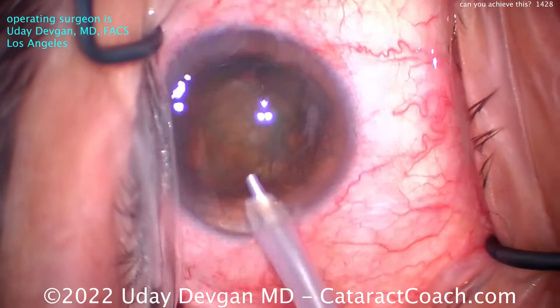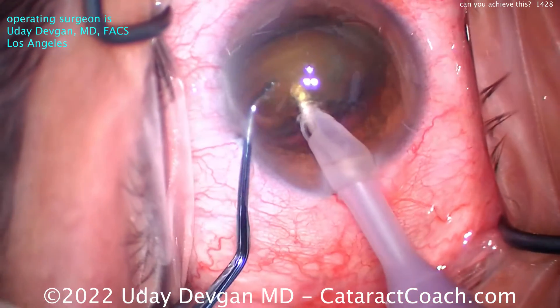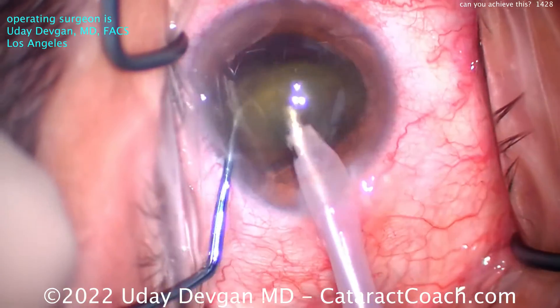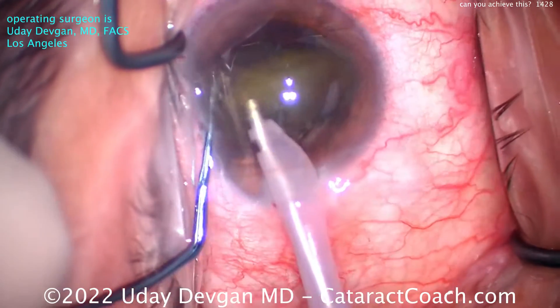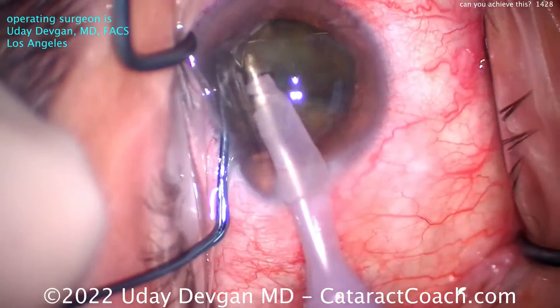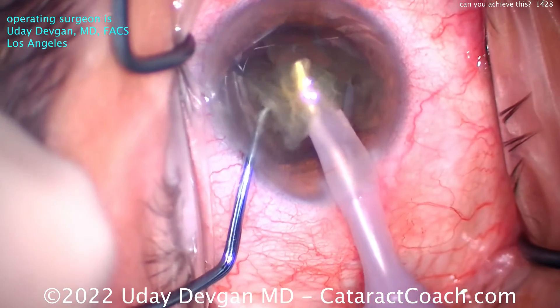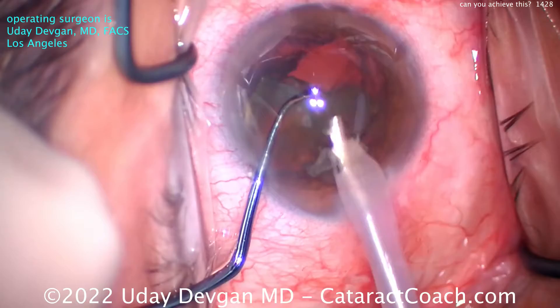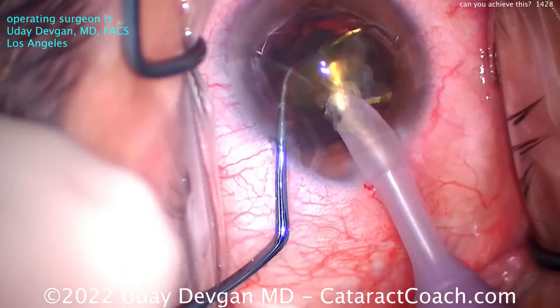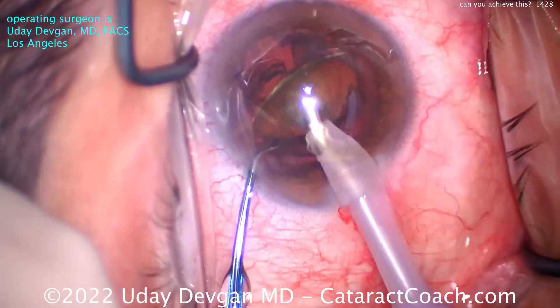Now you notice a lot of flow coming from my phaco tip. I'm using a high flow rate, 40 or even 50 cc's a minute. The nucleus, which is on its side, is now chopped and there are two halves. Each half can now be emulsified pretty easily. I'm making good use of phaco power modulations to minimize the total ultrasonic energy placed in the eye. After the one chop, I'm essentially just pushing that heminuclear piece towards the phaco probe. Here's the second half coming up, and I can chop a little bit if I want.